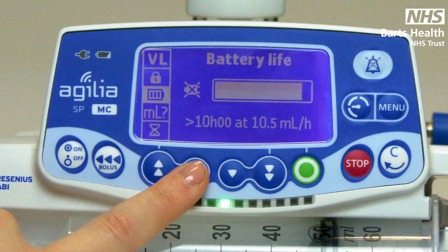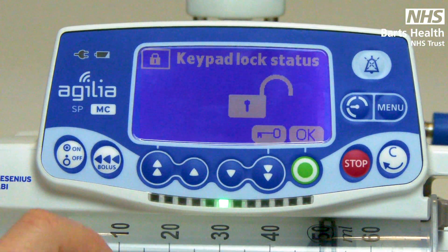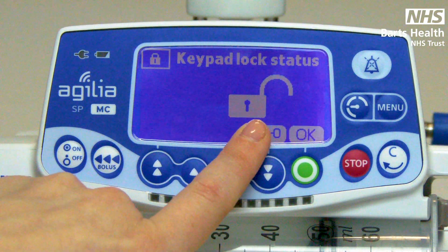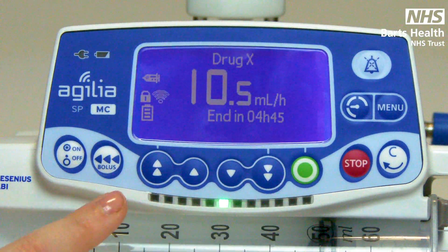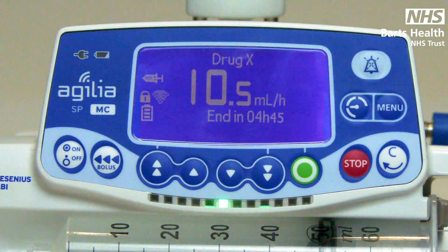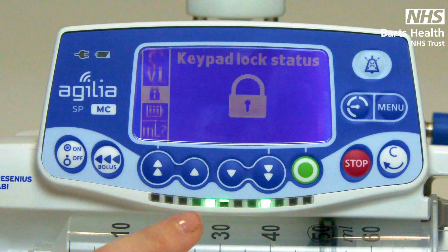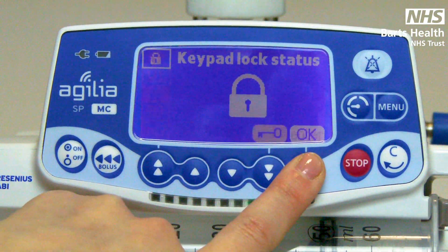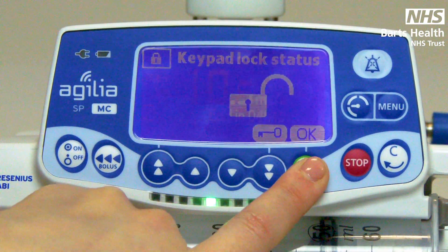In the menu you can find key padlock — it is your padlock symbol to the side. Press enter and then press your soft key underneath the key until the padlock is shown as locked. Confirm. This means no rate changes can be made to the pump. You could still stop the pump if there was an emergency. To unlock, go back to your menu to your key padlock function, enter, press under the key again until it shows unlocked and confirm.